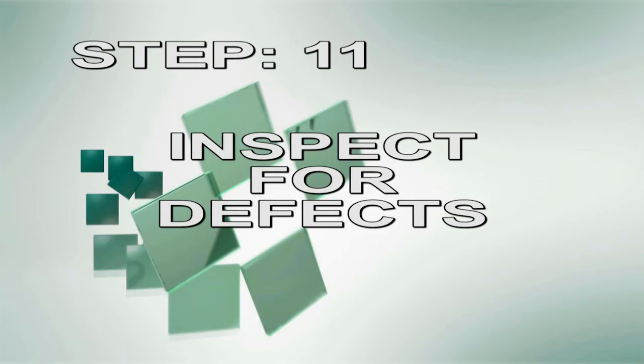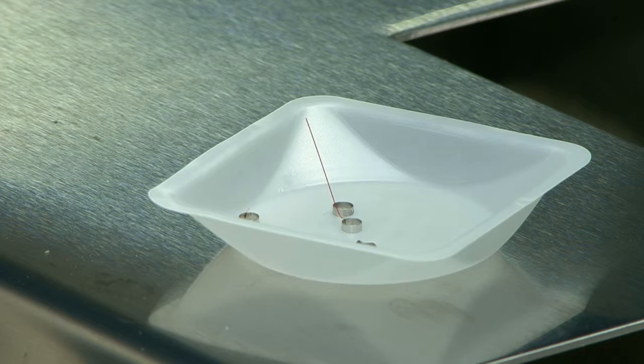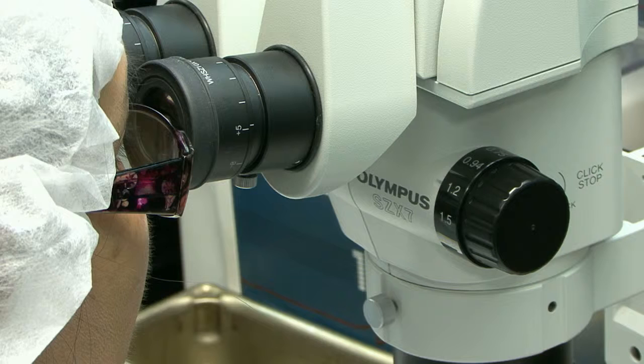Step 11. Inspect for defects. Now it's time to inspect your work. Scrap the piece if you see defects. For the visual inspection, set the microscope magnification dial to 1.2.